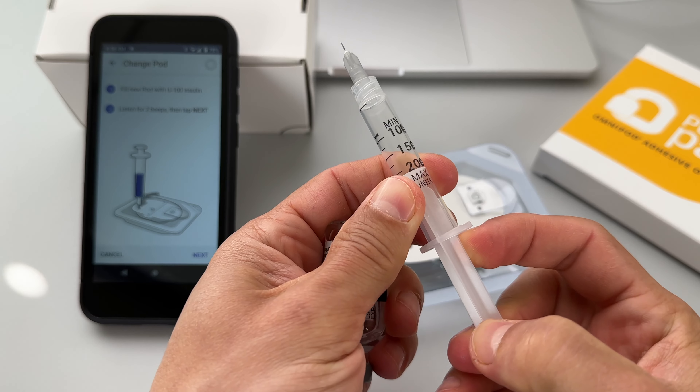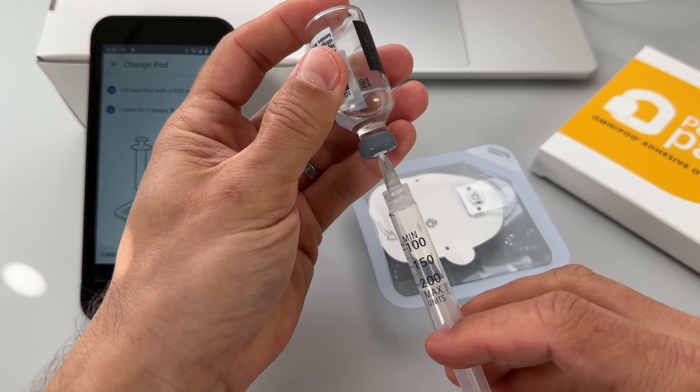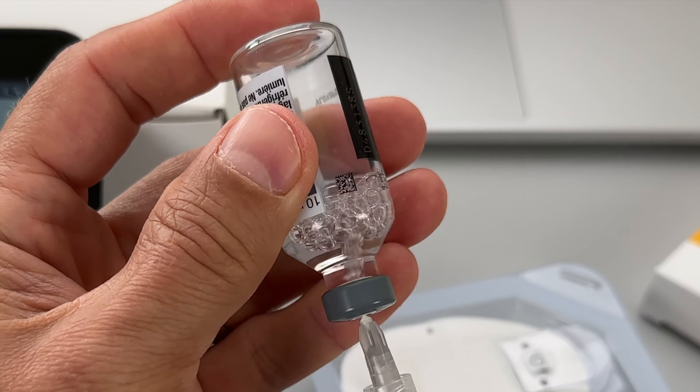I had already created my Omnipod ID account and went through the required training. Just for your information, the system doesn't put any roadblocks in your way, so you can make it work even if you haven't completed the official training yet or even when you are outside of the US — but please don't skip the training just because I told you this.